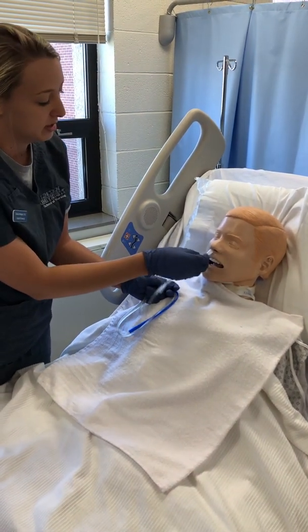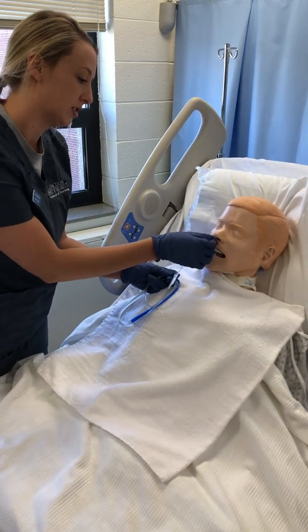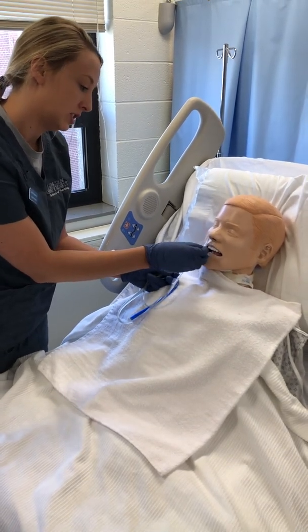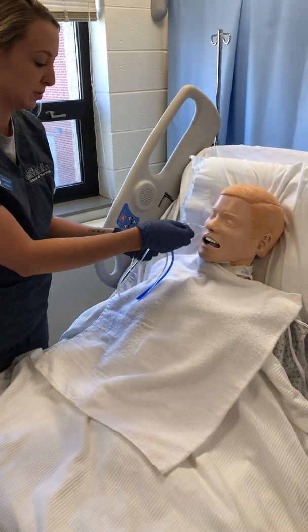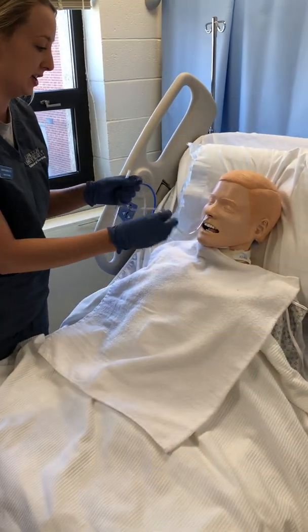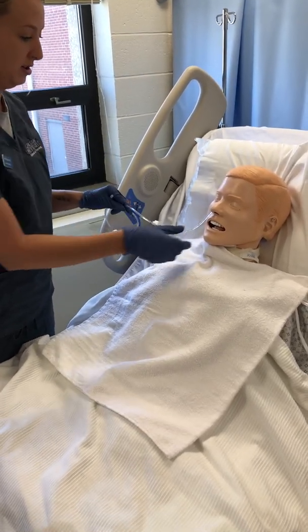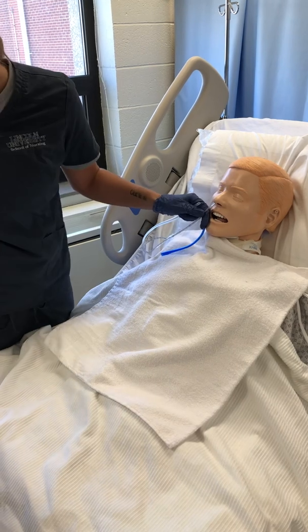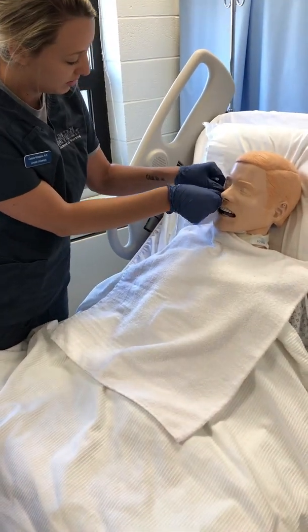If you're meeting resistance, then you could take it out, add more lube, and try the other nostril, or if they started coughing and were in distress, then you would remove the tube completely. For this purpose, the mannequins won't go all the way in, but you would go to your tape, but I'm going to leave it there. Once it's inserted, then you will put a temporary piece of tape on to hold it in place.